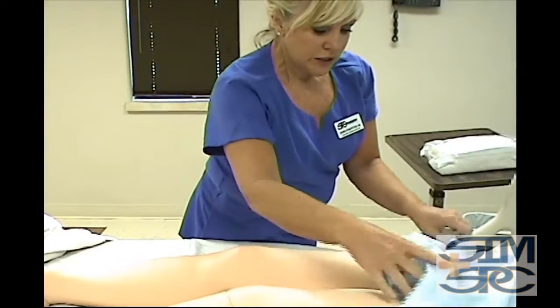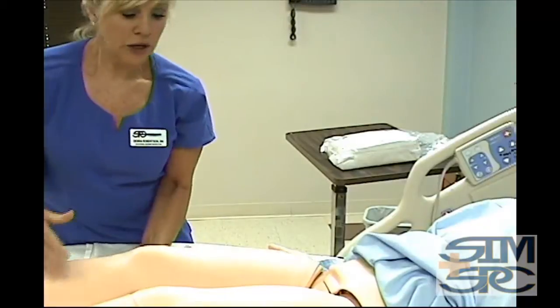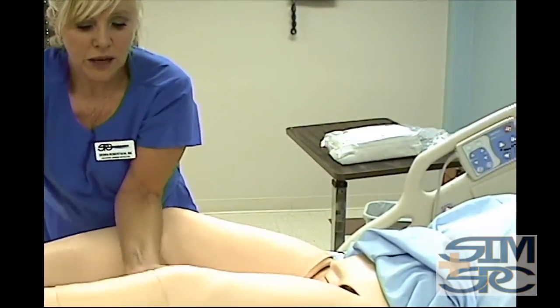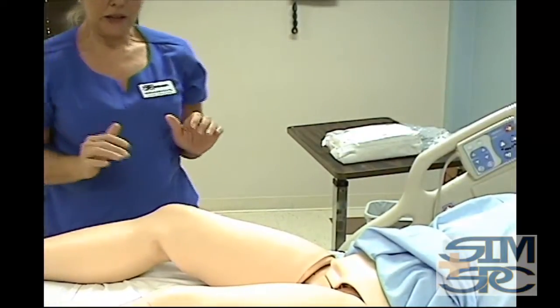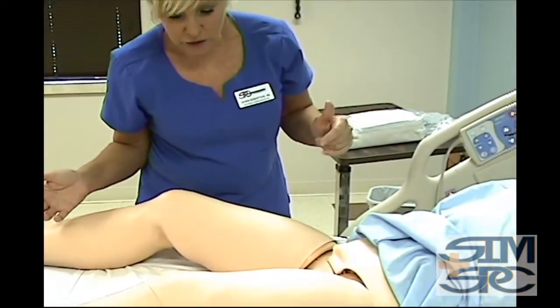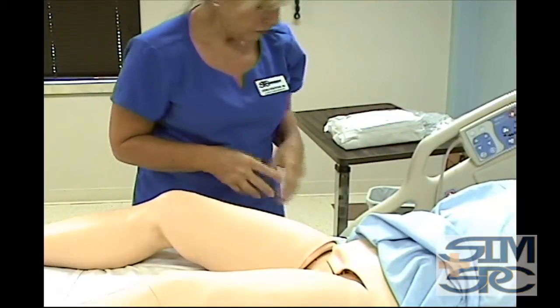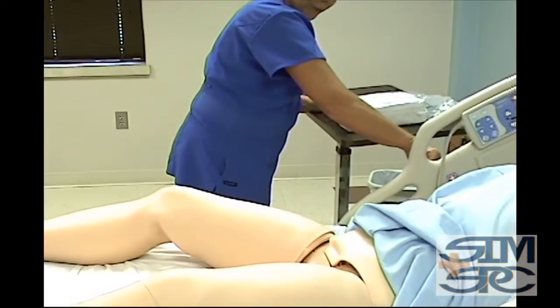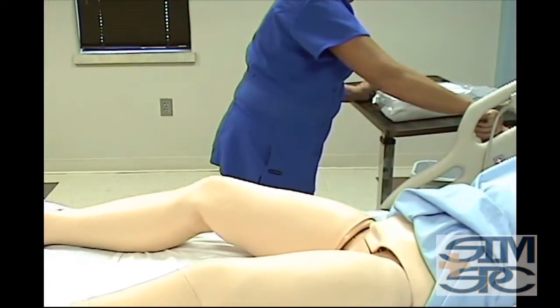What we're going to do then is get the patient ready for positioning, ready for the catheter. You need to explain to the patient that she's going to have to keep the legs in the bent position. She's going to be supine, but she needs to have her legs bent, and we're going to place our sterile field here in the middle. I'm going to go ahead and lower the feet because they tend to be up. And I'm going to go ahead and raise the bed up just a little more for me.